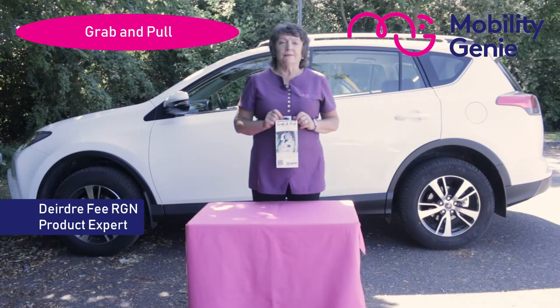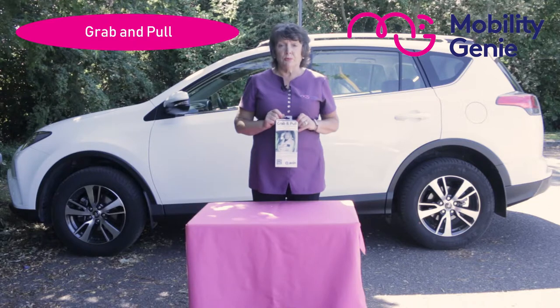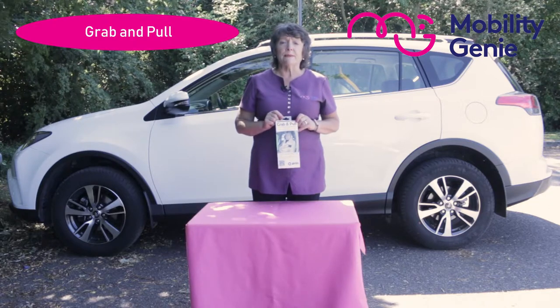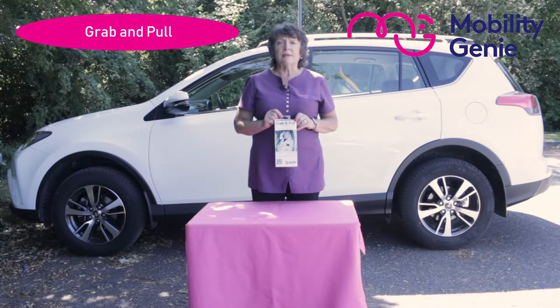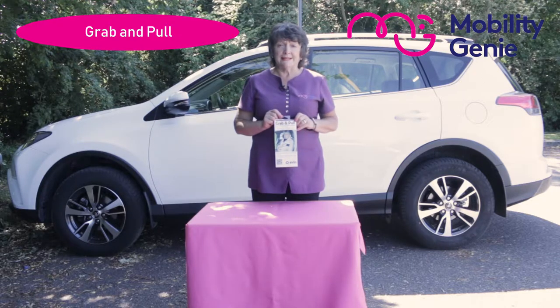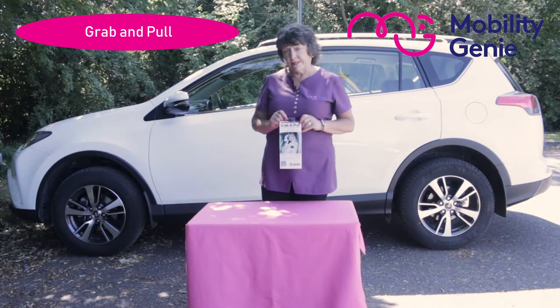Deirdre from Mobility Genie. At Mobility Genie we recommend the grab and pull. It's a snap-on attachment that makes your seat belt easier to reach. At Mobility Genie we're constantly being asked for a solution to the problem that a person may have when they've had shoulder surgery, or if they have arthritis or a back injury and they can't reach and twist easily to catch the seat belt. So it reduces the strain when twisting to reach for the seat belt.